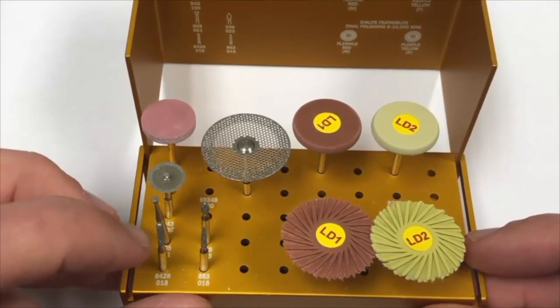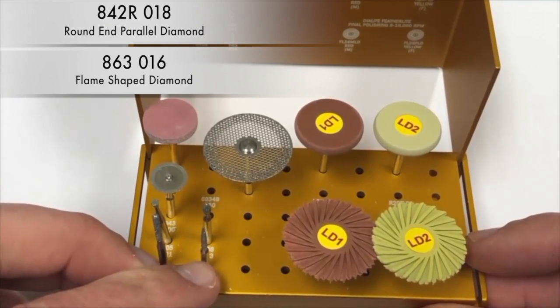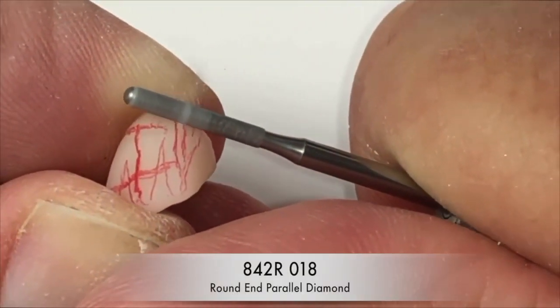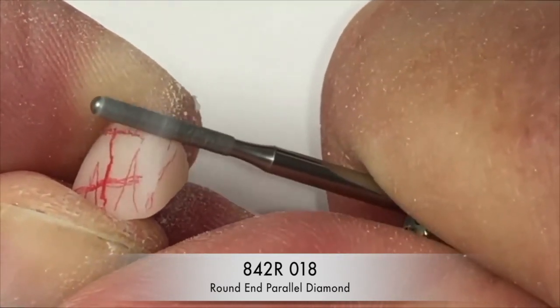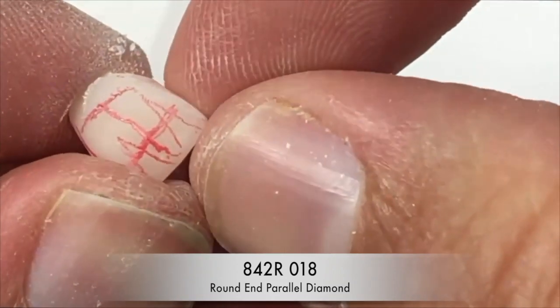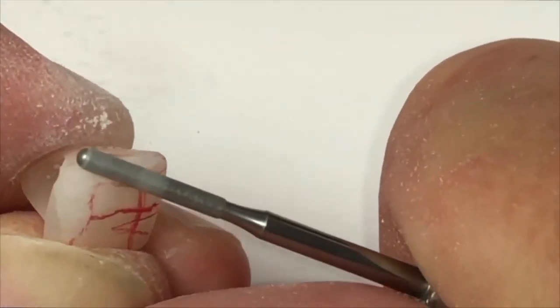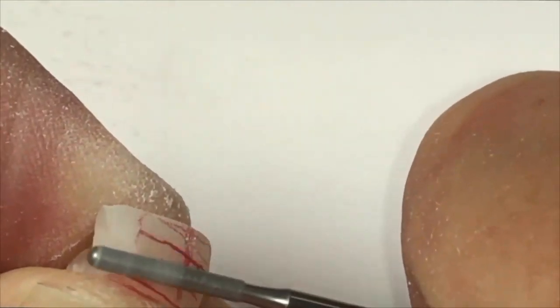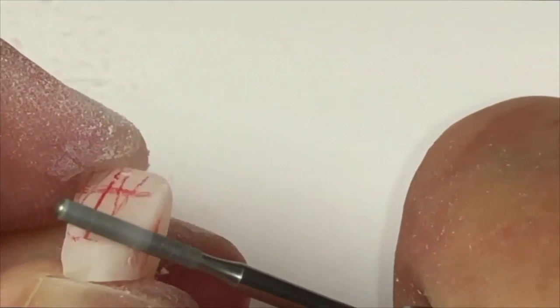The two main diamonds used for contouring and reshaping anterior restorations are the 842R018 and the 863016. The first step of contouring anterior restorations is to remove material in between the line angles and the contact point — this will narrow the restoration and sharpen the line angles. Next, material is removed below the height of contour, which will narrow the emergence from the tissue, preventing a bulky-looking restoration. Then we go to the other side and sharpen up the line angle between the line angle drawn and the contact point.